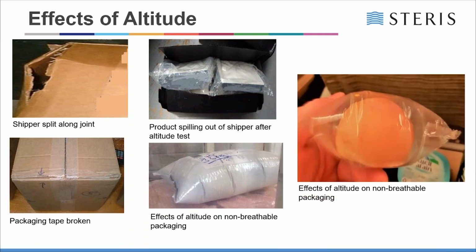You've probably all seen it when you're going on an airplane, when they serve you food these days. This is actually a picture from 2018 in Malaysia, where they served lunch on the plane, and this is how the roll came out. Lovely pillow effect on the package itself.